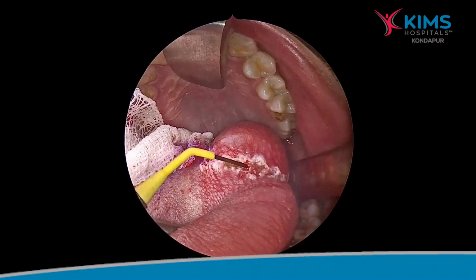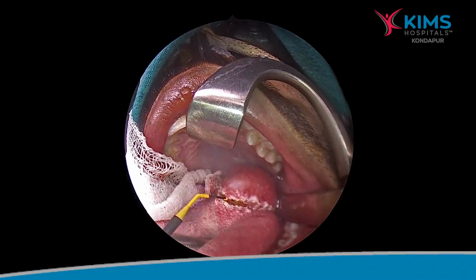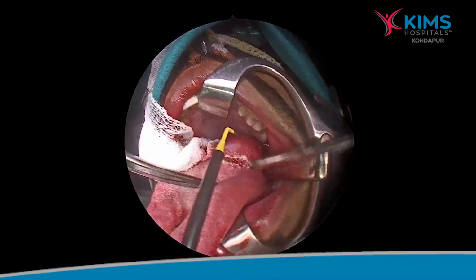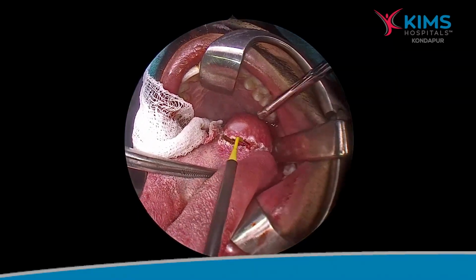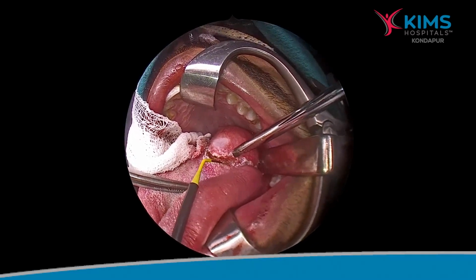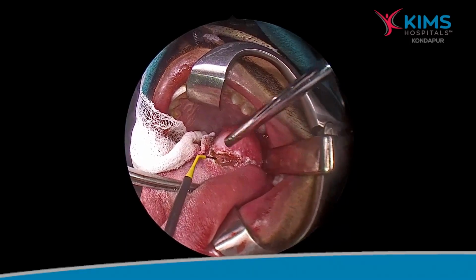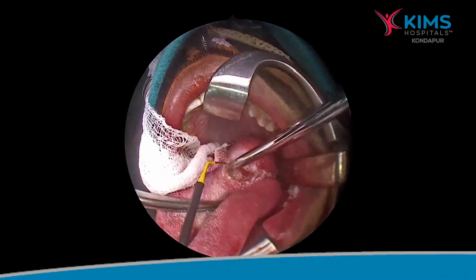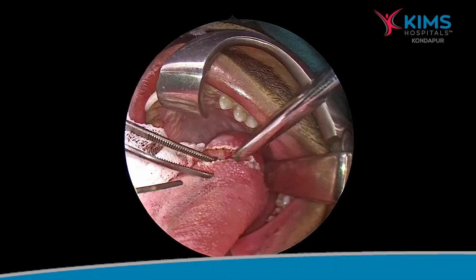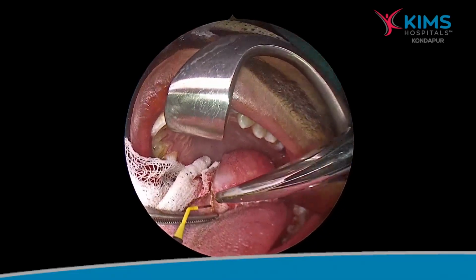Now this is the radiofrequency needle. You can see where I am giving the incision, starting at the anterior border, where we had initially cauterized with the Coblator wand. We did not go directly into the tumor. A superficial incision is given. The idea is to get a plane between the tumor and the muscles of the tongue. So, absolutely no bleeding, you can see.